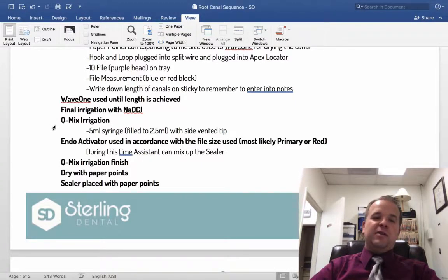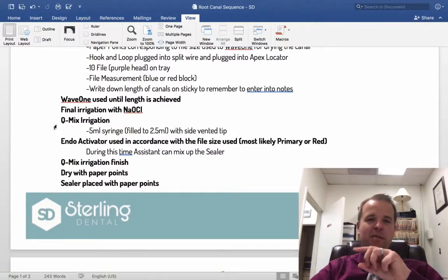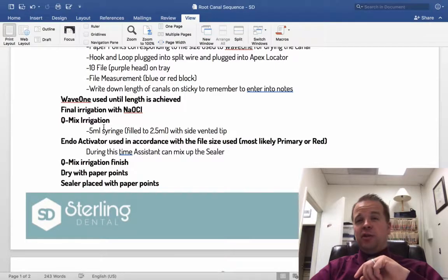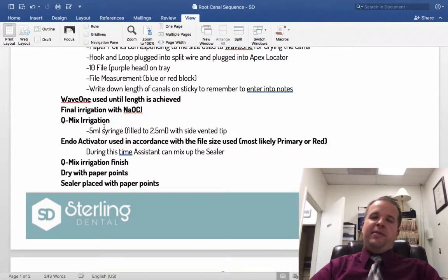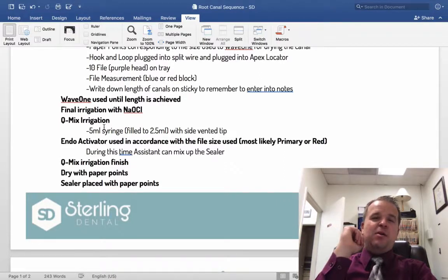Then you'll even use a more expensive and toxic substance that'll stay in the tooth to help make sure that bacteria don't come back. And that's what we use, it's Q-Mix, it's an EDTA solution. This one we don't use a lot of. You'll fill up only about 2.5 milliliters. You only need about 1/10 of a milliliter per canal, but we do a little bit of extra just to make sure that everything's rinsed out really well. You'll do the final rinse of the Q-Mix.